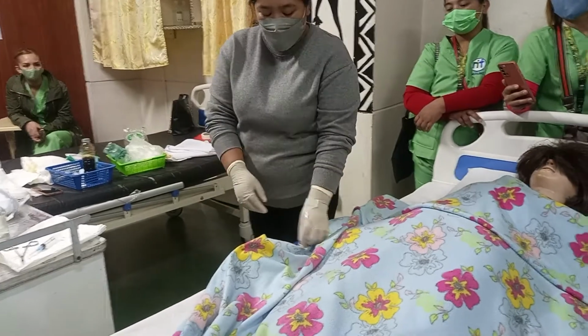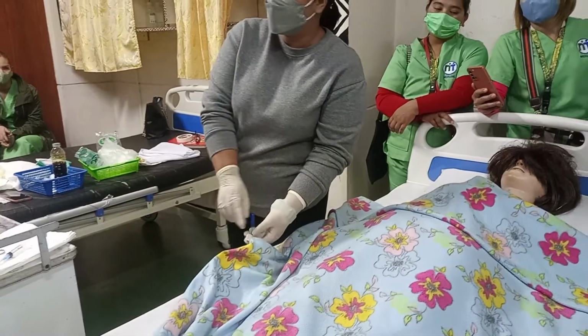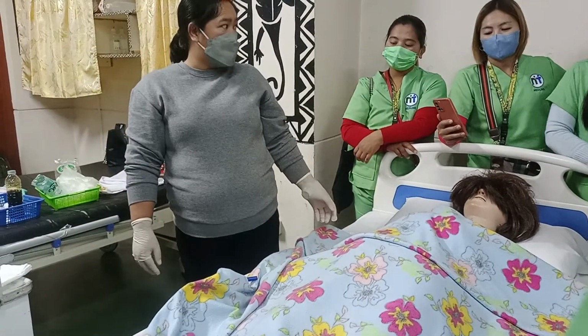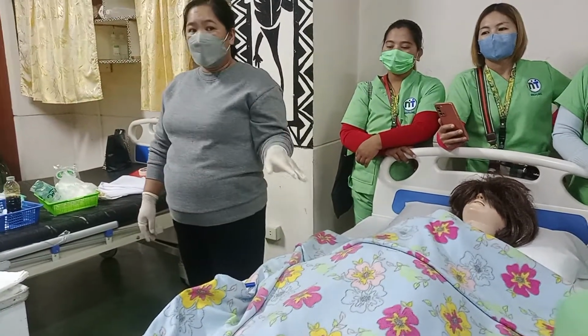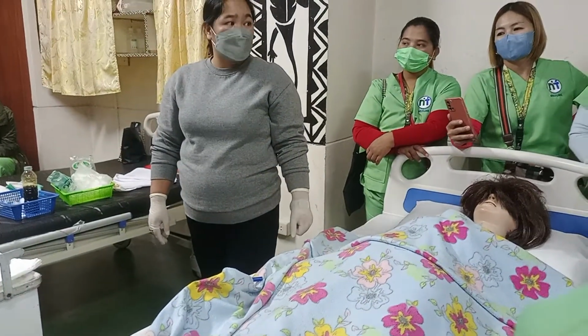And then you're going to release it for 2 hours. And then you're going to kink it again for the next 1 hour hanggang sabihin ni patient na naiihi na siya. Okay. So kapag naiihi na siya, positive, bumalik na yung function ng bladder, magtatanggal na tayo ng catheter.